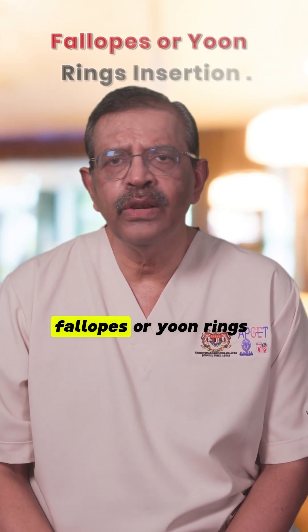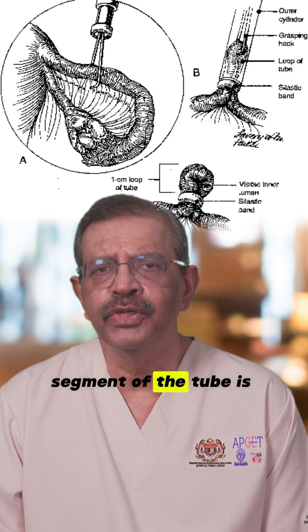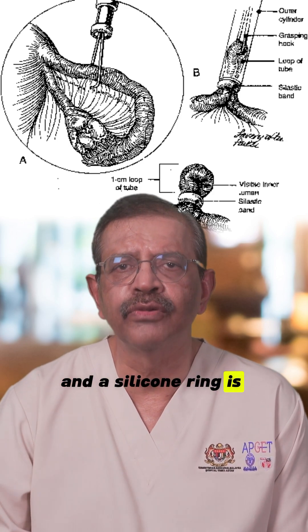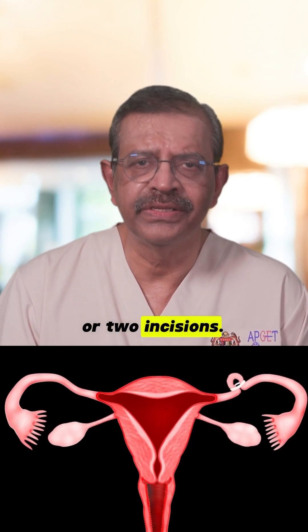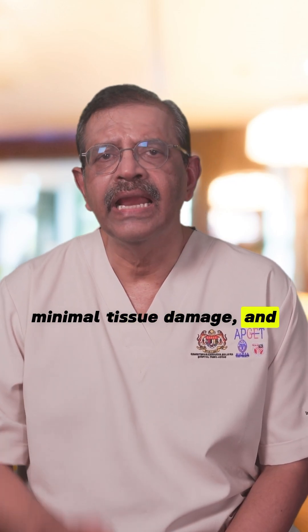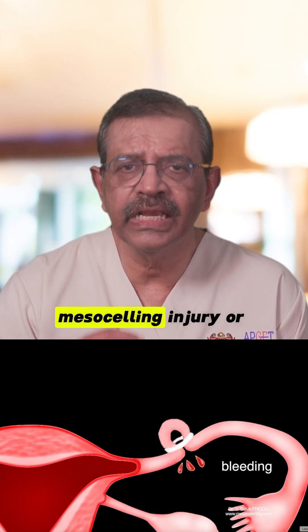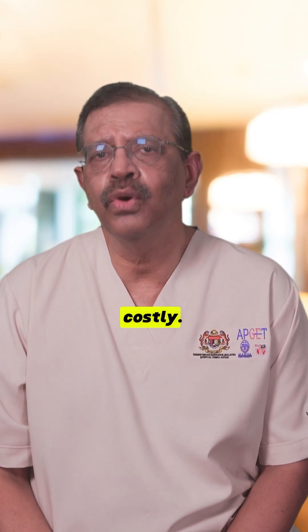Number 2: Fallope or Yoon rings insertion. A 2 to 3 cm segment of the tube is drawn into an applicator and a silicone ring is released to block it. This can be done with one or two incisions. The advantages are minimal tissue damage and suitability for tubal reversal. The disadvantage is a risk of mesosalpinx injury or bleeding, and the rings are also costly.